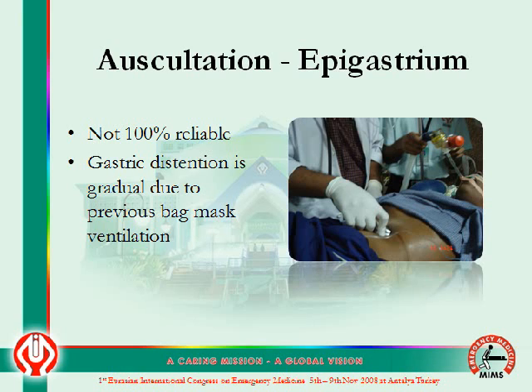Is it 100% reliable? Definitely not. Especially if your patient received bag mask ventilation, which causes incidental inflation of the stomach and gastric distension, this may sometimes give a wrong idea of the tube position.